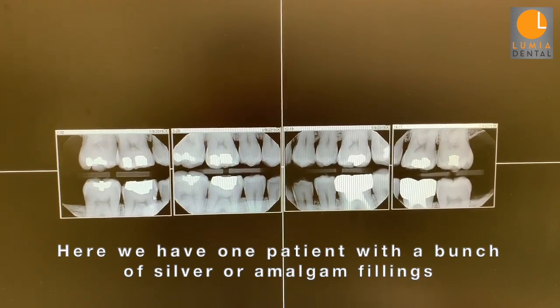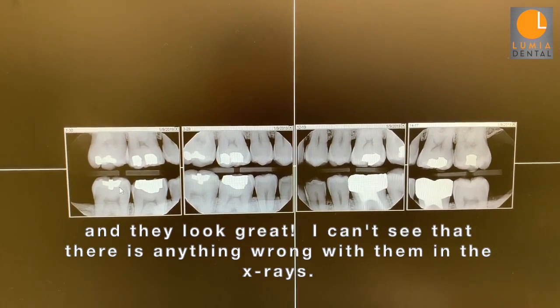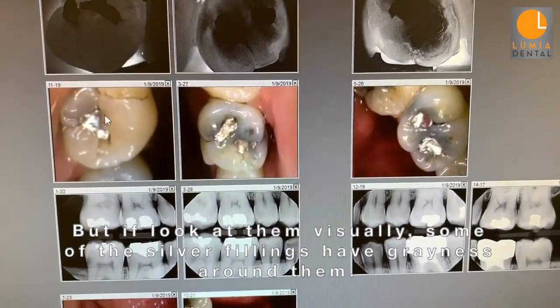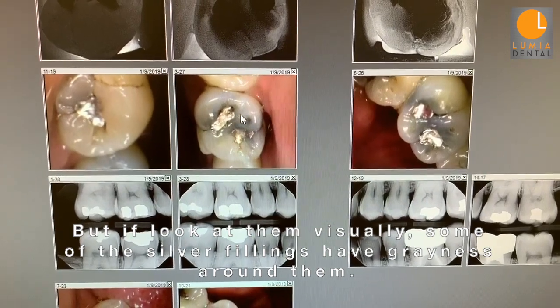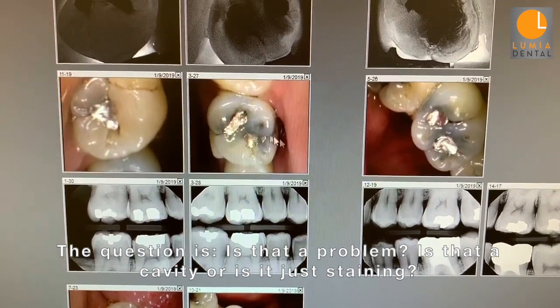Here we have one patient with a bunch of silver or amalgam fillings, and they look great. I can't see that there's anything wrong with them in the x-rays. But if I look at them visually, some of the silver fillings have grayness around them, but the question is, is that a problem? Is it a cavity or is it just staining?